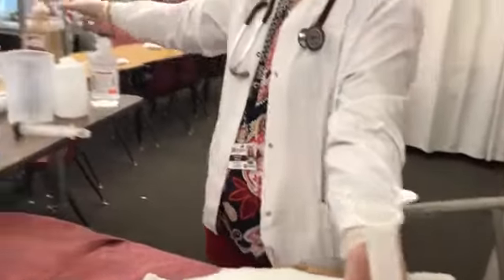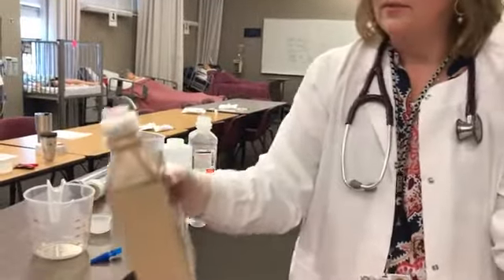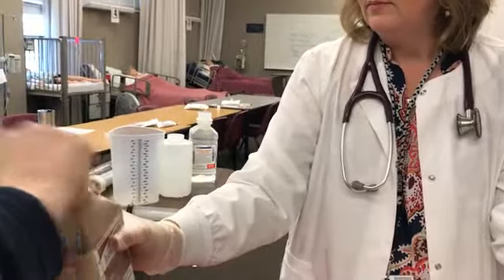The Jevity that I'm going to use, the doctor says to use 100 cc's. So we'll pour that up. It has a cap on it.